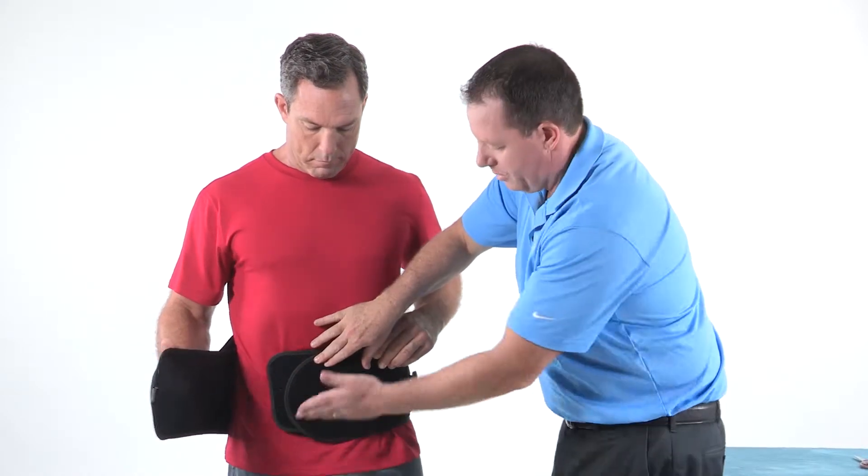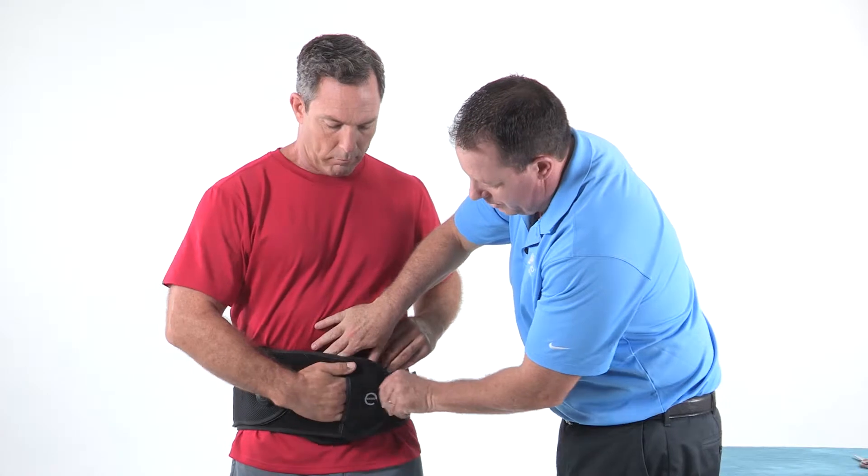Next, have the patient secure the hook closure on the front and ensure that the belt is snug.